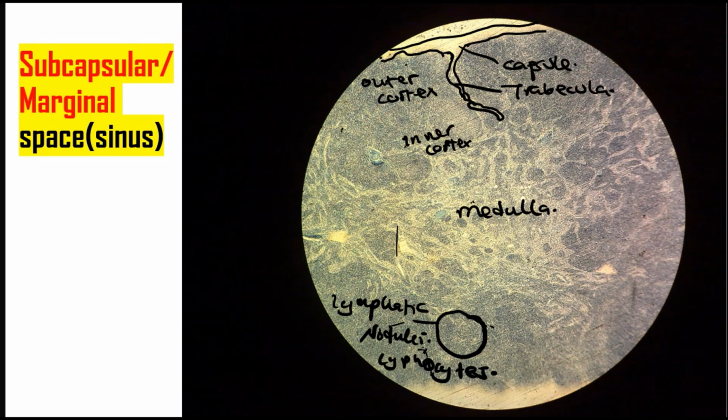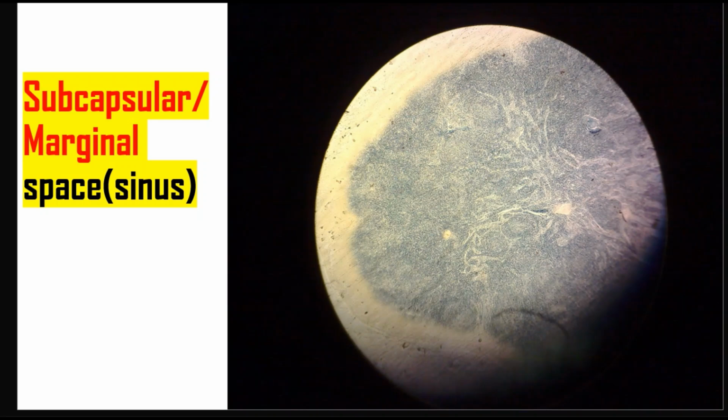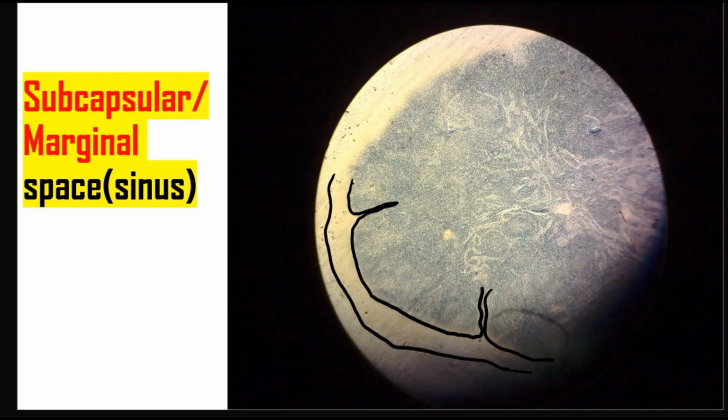So at low power, this is what we can see. So this is a capsule here. This is the inner capsule that is sending trabeculae, capsule, trabeculae, capsule, and then you've got these nodules. You've got a nodule here, a nodule here, a nodule here, a nodule here.